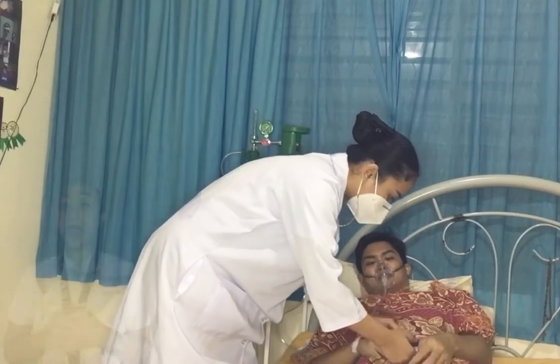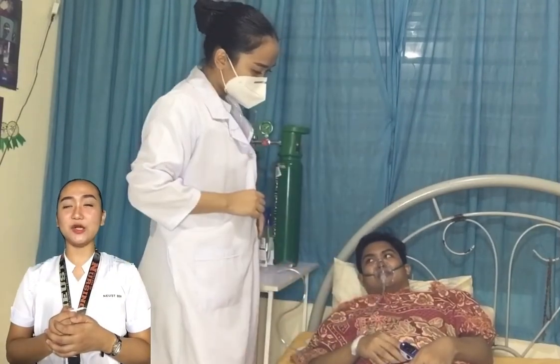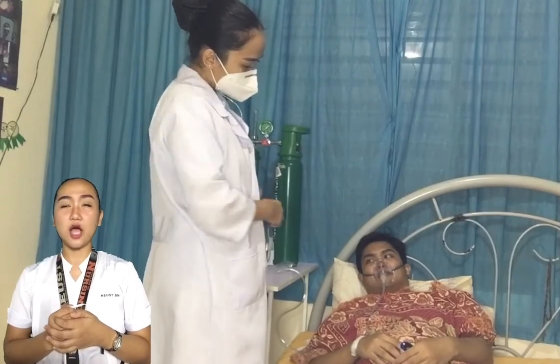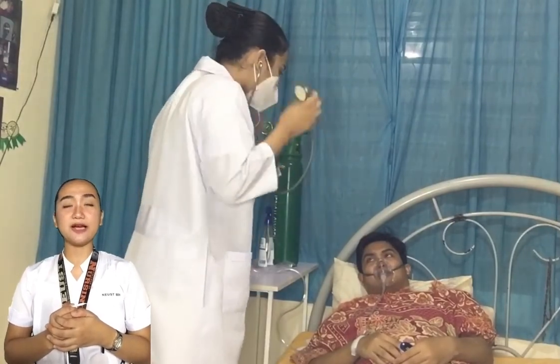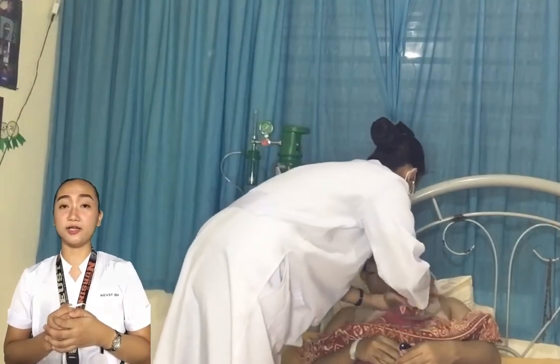Assess the patient's respiratory status, including respiratory rate, effort, and lung sounds. Note any signs of respiratory distress such as tachypnea, nasal flaring, use of accessory muscles, or dyspnea.